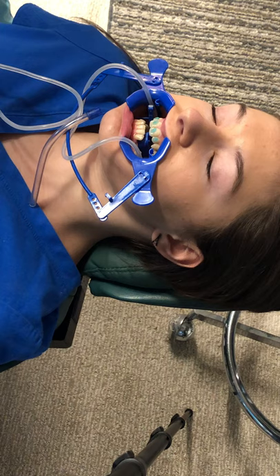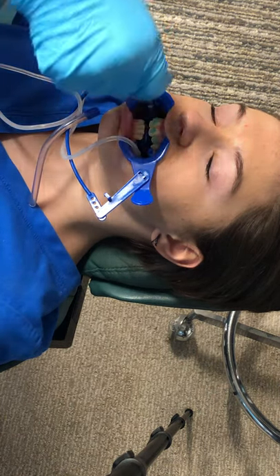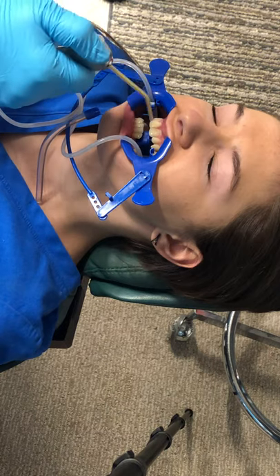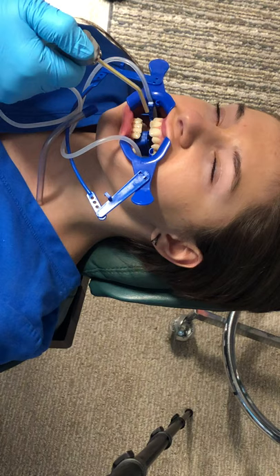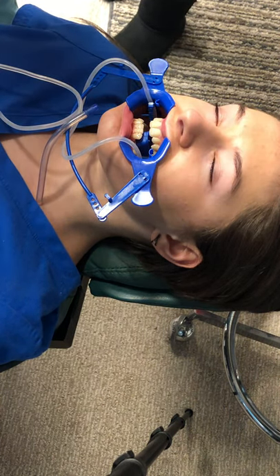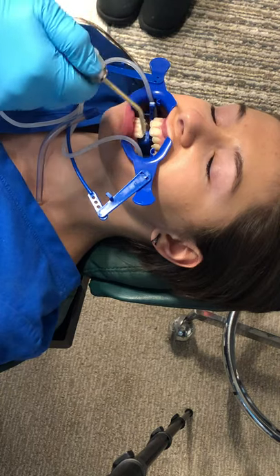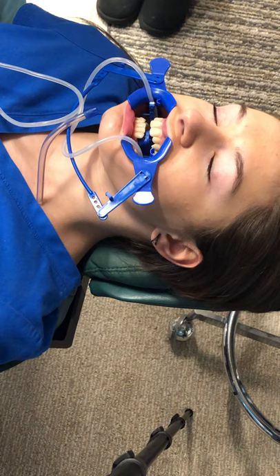After 30 seconds, we would take a high volume evacuator and suction that off, then air dry it. Can you see how chalky it is? It's not as glossy anymore. I'm just going to dry it off a little bit more. Even with the lower teeth dry, look how much glossier that is by comparison.